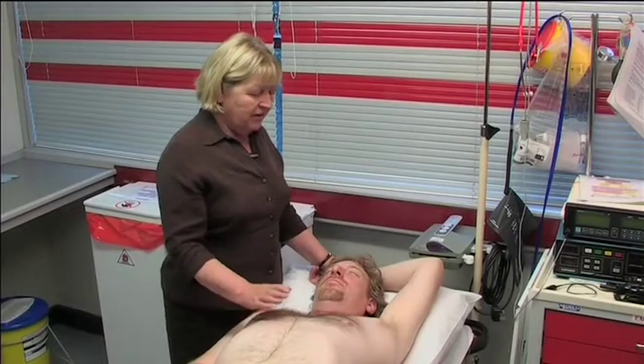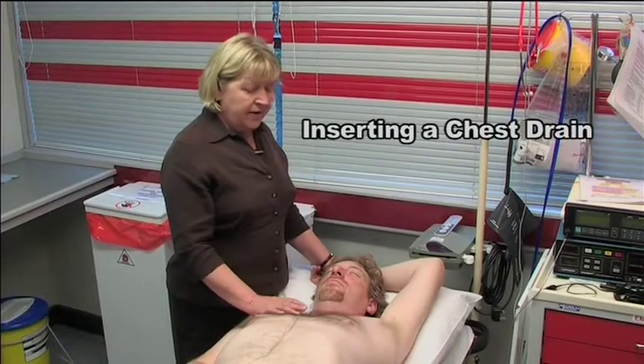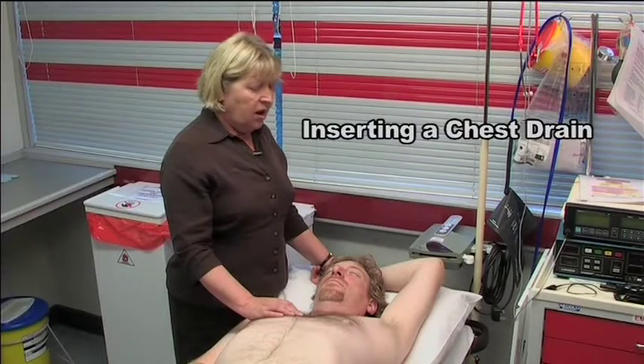We're now going to look at the insertion of a chest drain. Remember, it's never an emergency. You would only ever have to insert a chest drain on the advice of your medical advisor.